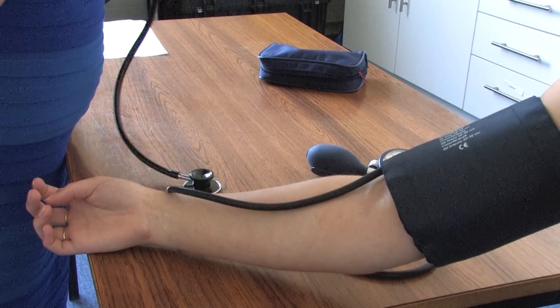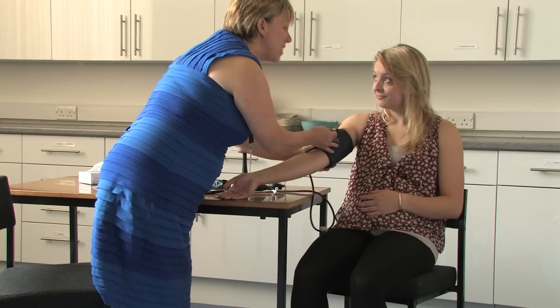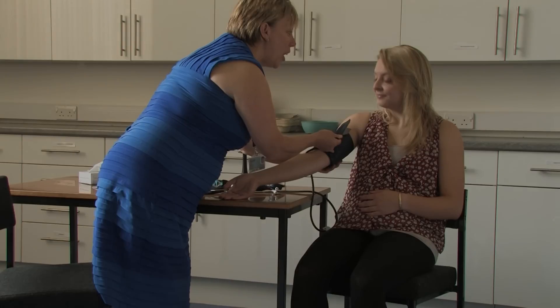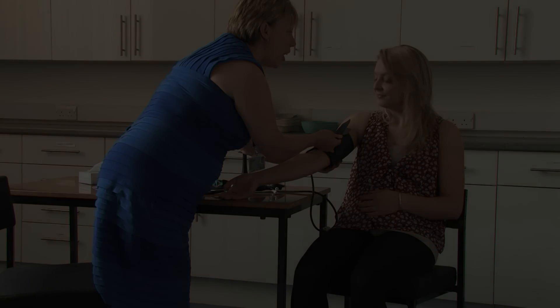Discuss with the woman your findings and document the reading. Then encourage the woman to adopt her position of choice and ensure that you act on any abnormal findings.